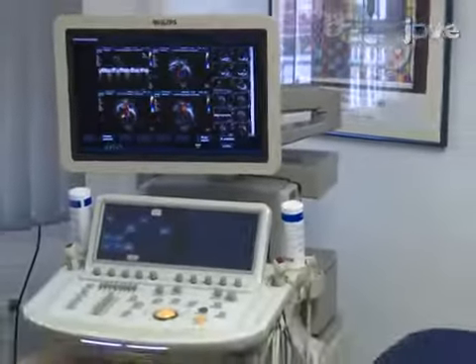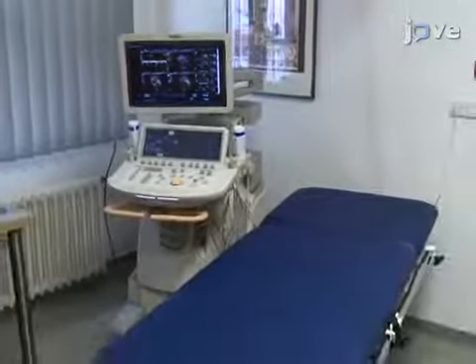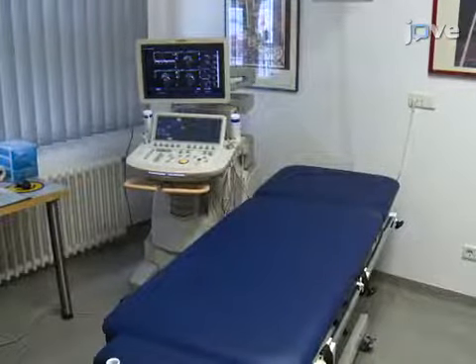Begin by acquiring an echocardiography device featuring speckle tracking technology, or STE, equipped with an adequate sector array tissue harmonic imaging transducer.